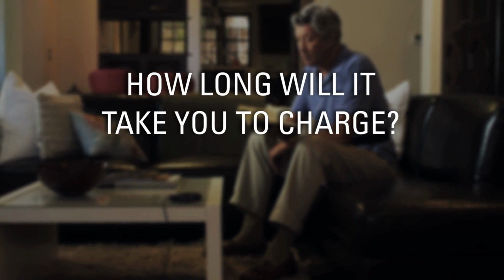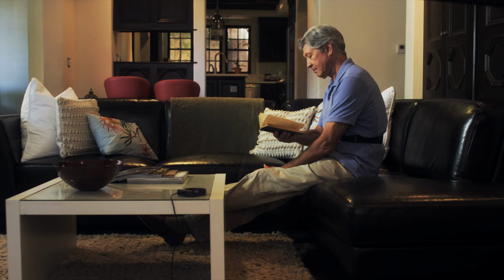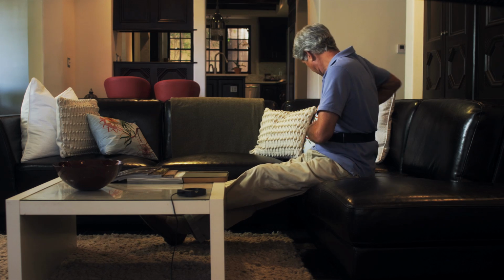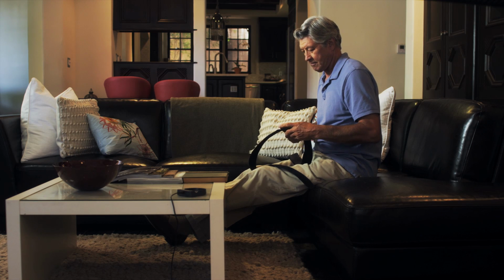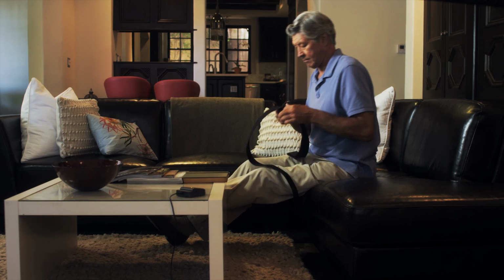How long will it take you to charge? Charge time varies from person to person. How frequently you have to charge depends on how many hours per day you use your stimulator and also the strength of your program. The longer you wait between charges, the longer charging will take. If you find you want to shorten the charging time, simply make sure to charge more frequently.